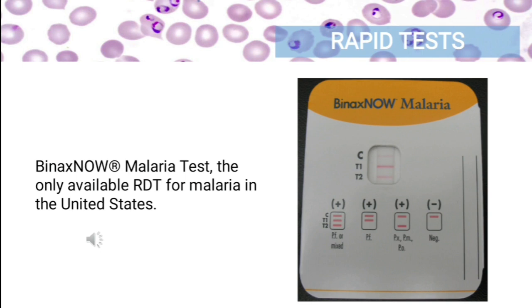Currently, the only available RDT for malaria in the United States is the Binax Now malaria test. The Binax assay contains both the HRP2 for Plasmodium falciparum and aldolase, which is a pan-malarial antigen. It cannot separate non-falciparum species. The Binax assay should always be accompanied by thick and thin film microscopy.